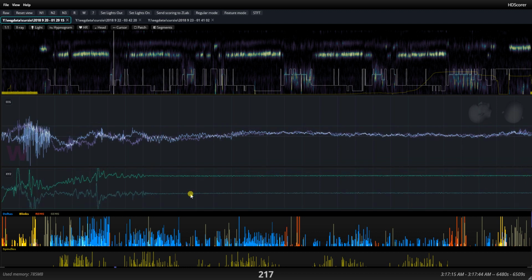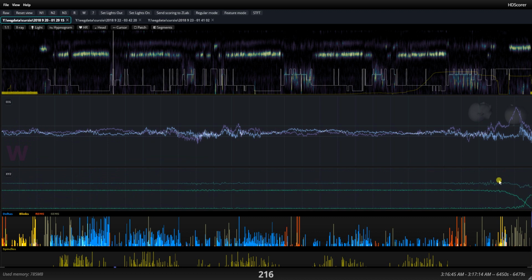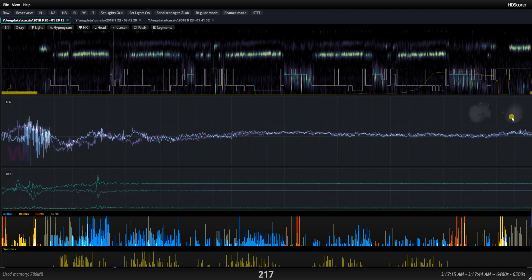It's moving around considerably. They're also changing position, because you see that these three green lines are representing X, Y, and Z. They cross. They end up in a different position than they started. So there's a change in movement. Oh, silly me, I've got the head here. So do you see that there's a change in head position as I move back?